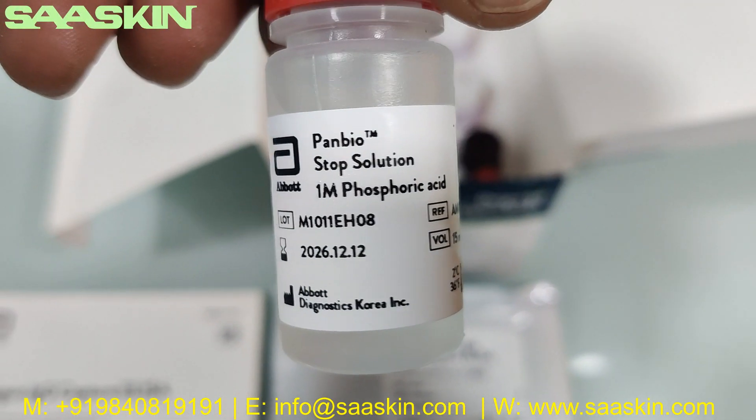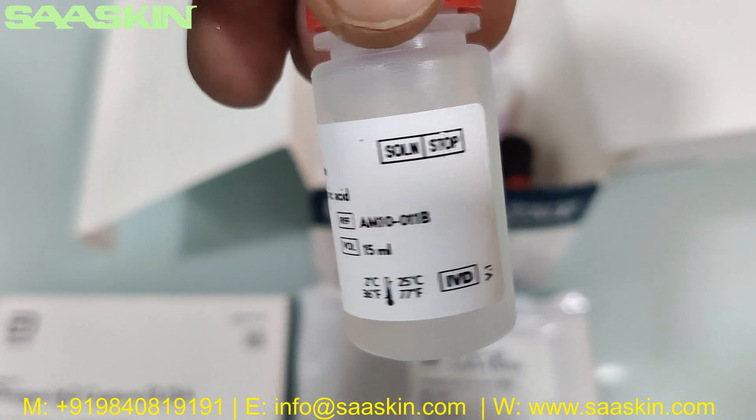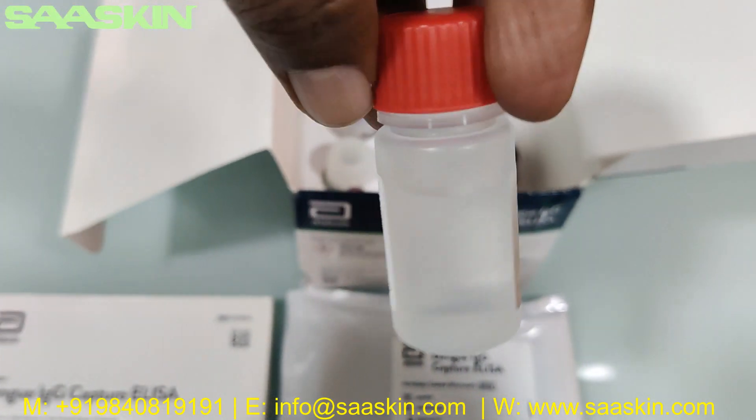This is the Panbio stop solution — 1M phosphoric acid, 15 ml. You can see what this bottle looks like.